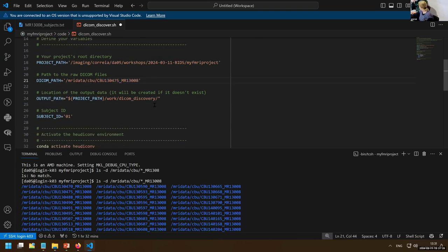Can I ask a question? Often things don't go ideally, and one of your subjects has an extra session which was aborted because that went wrong, and you restarted. So sometimes you can't assume that every subject's exactly the same. Could you discover on a CBU star basis, or how do you cope with the fact that one subject may have a different number of sequences or an aborted sequence?